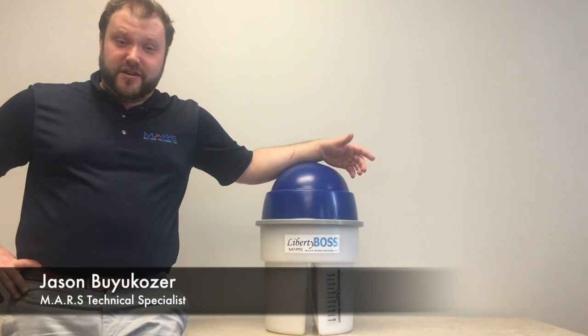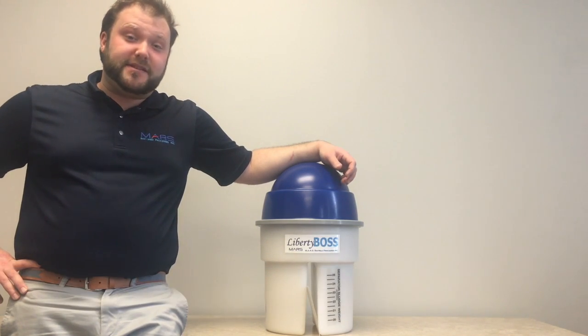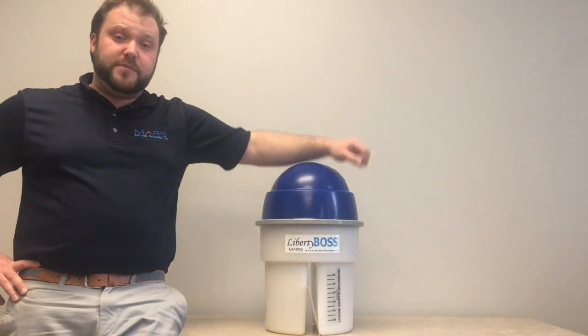Hello, this is Jason Buges, technical specialist at Mars BioMed. Today's preventative maintenance course will discuss the required maintenance of the Mars Liberty Boss.